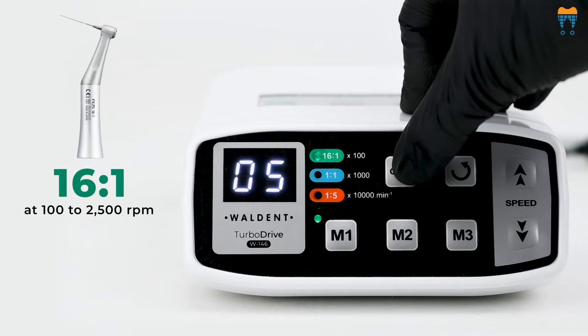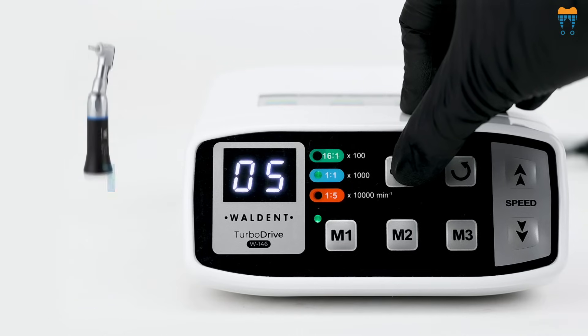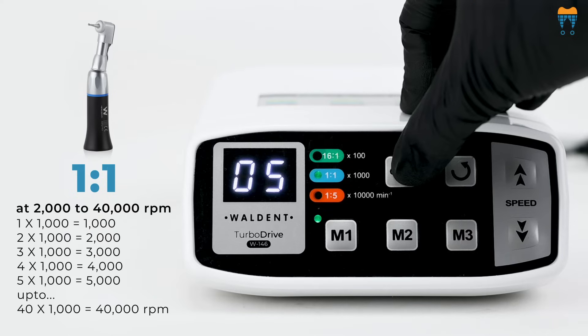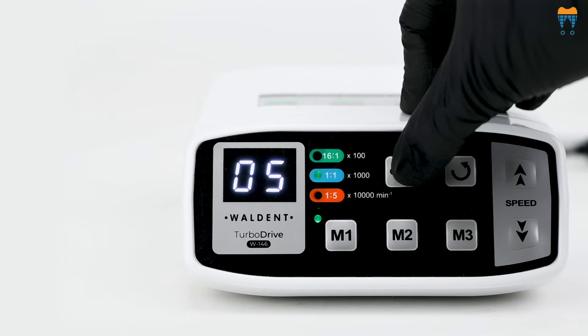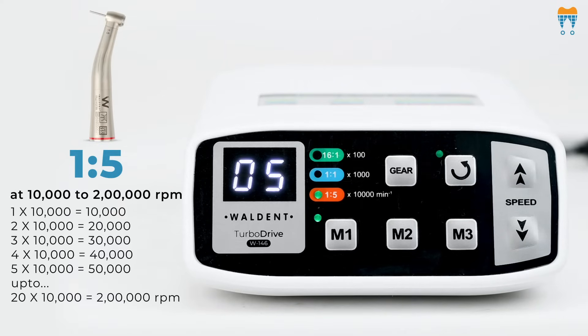The Walden TurboDrive offers a versatile speed range across different ratios. For 16 Ratio 1, at 100 to 2,500 rpm — to know the speed of the handpiece, the speed shown on the motor will be multiplied by 100. For 1 Ratio 1, at 2,000 to 40,000 rpm — the speed shown on the motor will be multiplied by 1,000. For the ultra-high-speed 1 Ratio 5, at 10,000 to 200,000 rpm — the speed shown on the motor will be multiplied by 10,000.